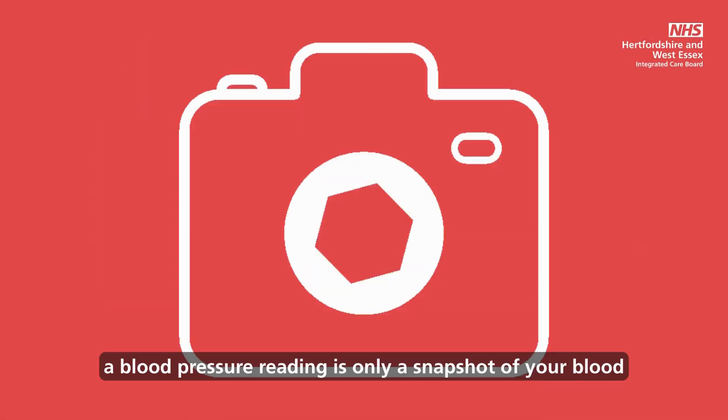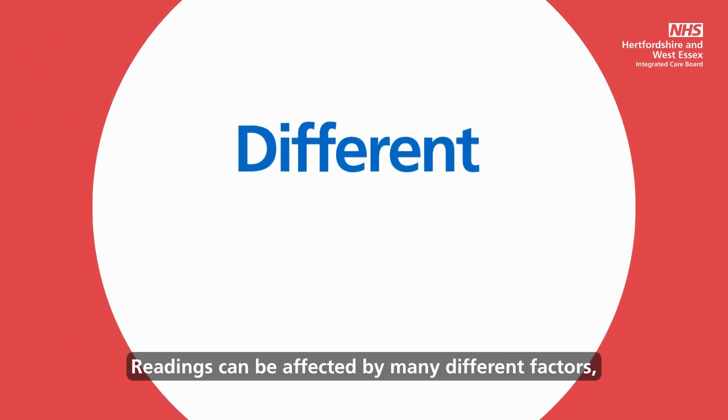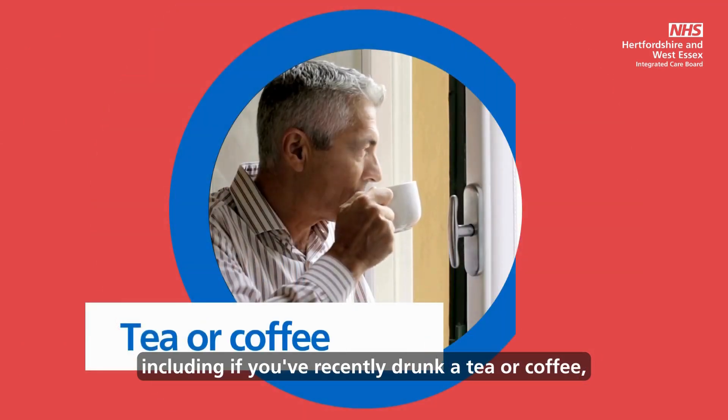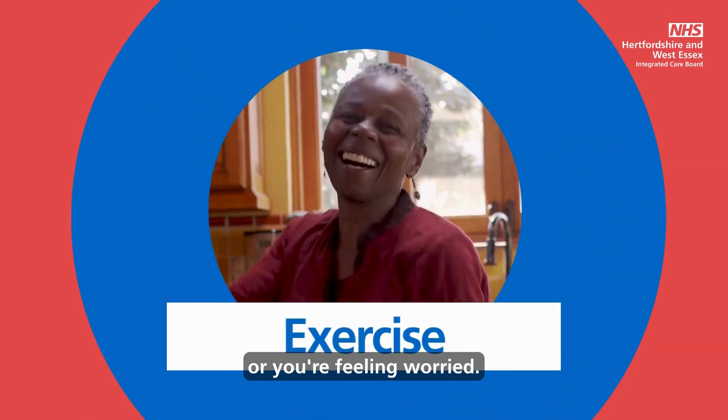Remember, a blood pressure reading is only a snapshot of your blood pressure at this moment in time. Readings can be affected by many different factors, including if you've recently drunk a tea or coffee, done some exercise, or you're feeling worried.